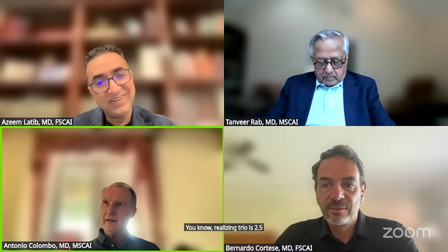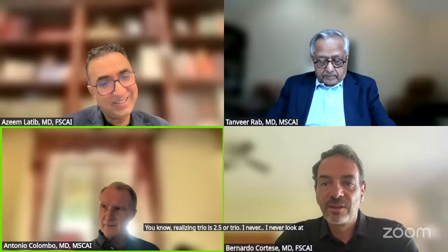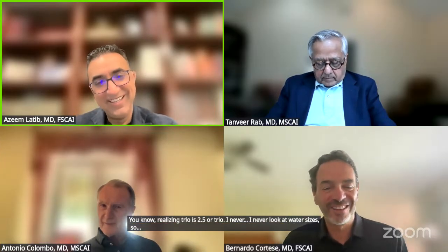Less than 3.0 is 2.5 or 3.0. I never look at the in-between sizes. So not 2.75. Well, we don't keep those sizes.